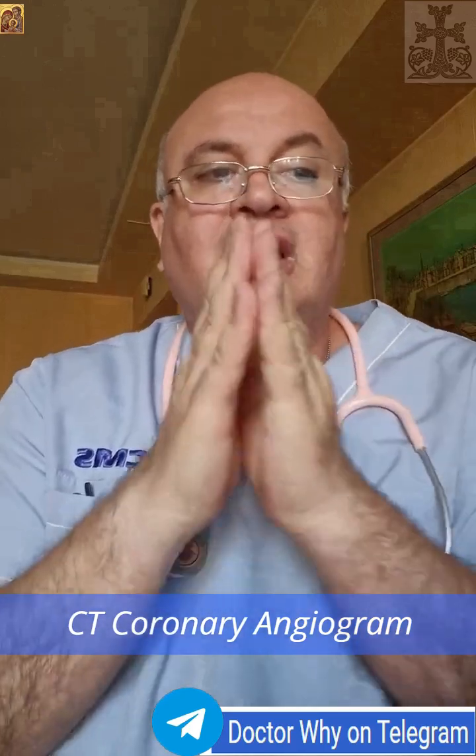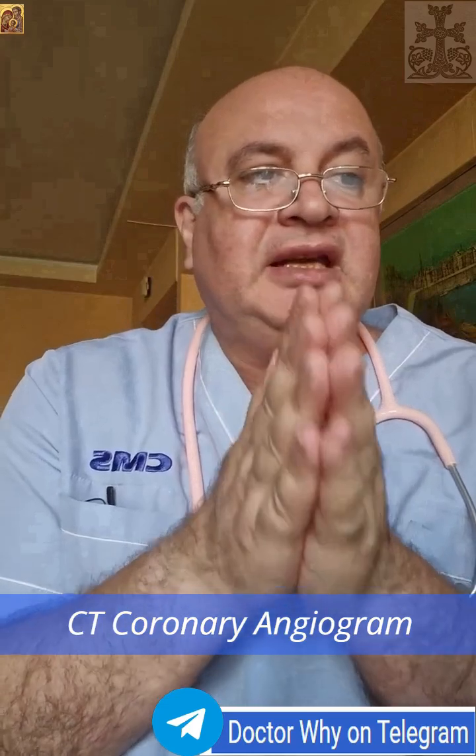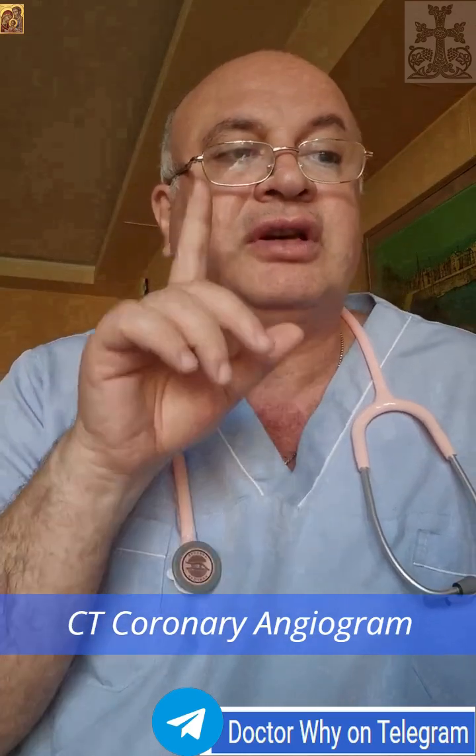Traditional angiography can only see the vessel lumen, the hollow where blood flows. But CTCA shows the entire arterial wall, allowing us to identify non-obstructive plaques, the ones that may rupture and cause sudden myocardial infarction. That is why CTCA is often called the crystal ball of cardiology, and it can detect the disease before it strikes.